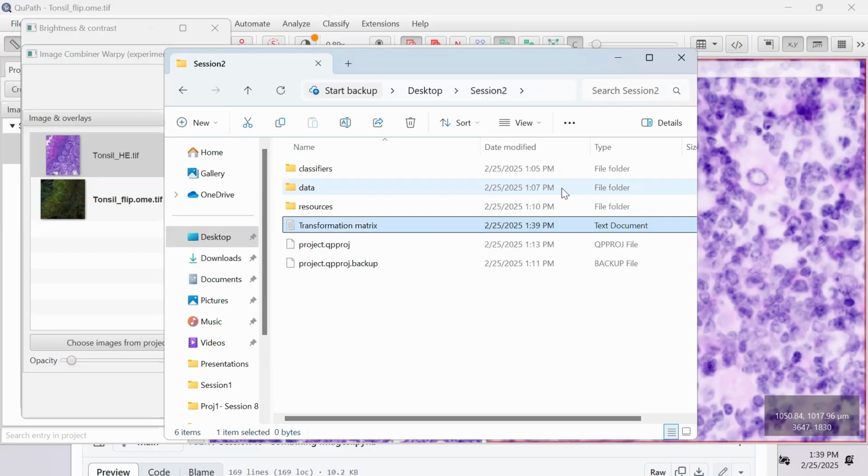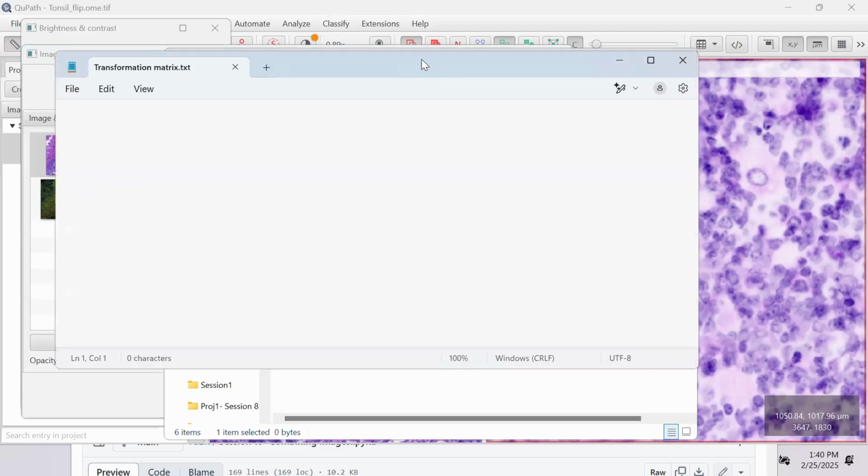And while this image is taken from the same physical slide, it's not pixel to pixel identical because you had to run an H&E stain on it. And that involves some steps of dehydration, and you do different things to your sample depending on the details of your staining procedure, but it's not going to be pixel to pixel ideal between your immunofluorescence and your H&E.